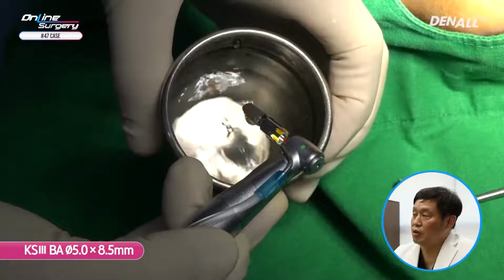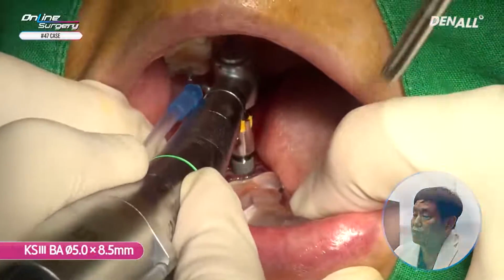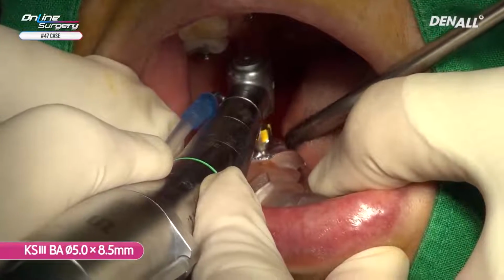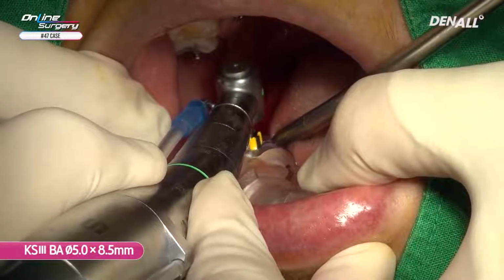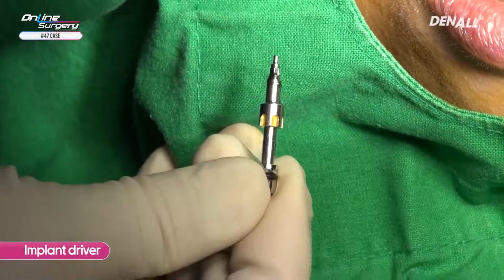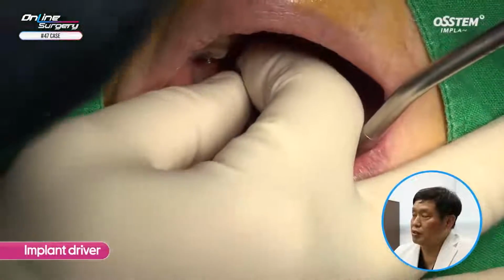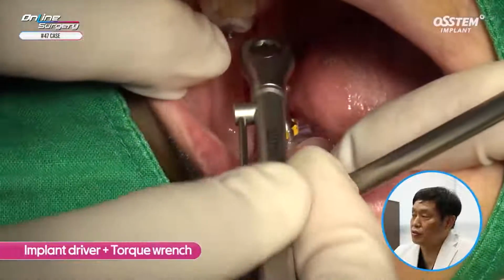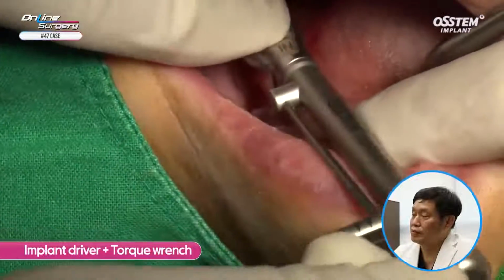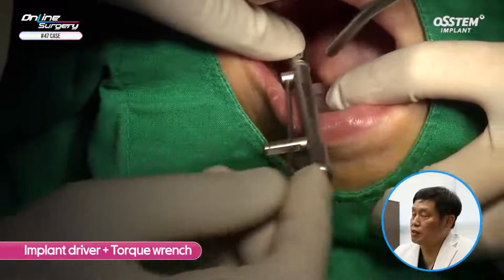The KS3BA surface is used. This is a hydrophilic surface. You need to irrigate it sufficiently using saline. And now I'm going to position the implant. Using the engine, I've placed it approximately 80%, and then using the implant driver, a torque wrench is used to get the final position. I am finding the slot, and to the desired depth, I am positioning the implant.